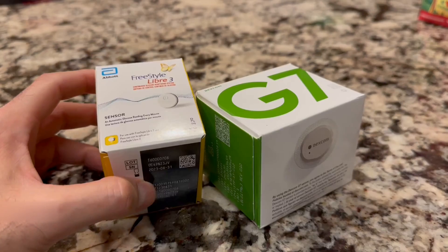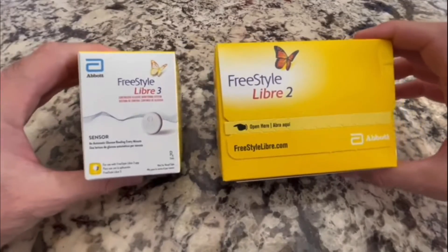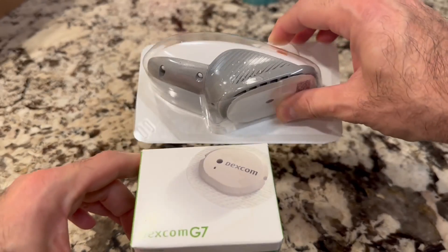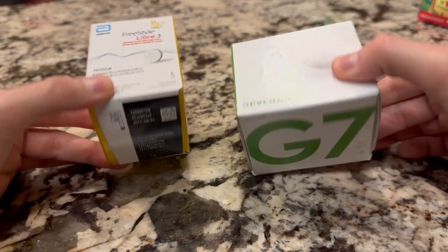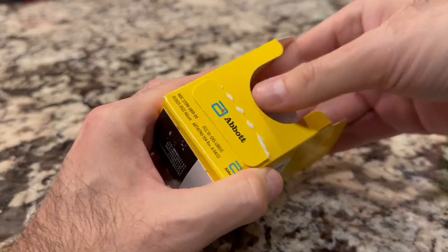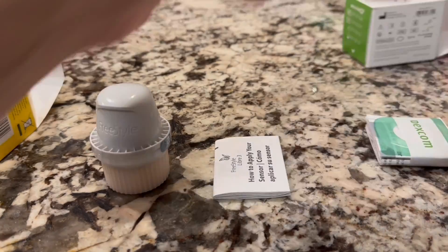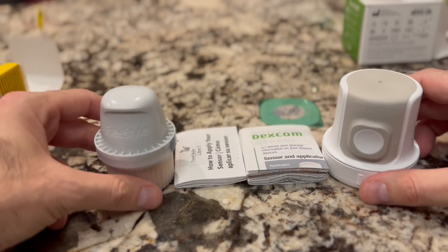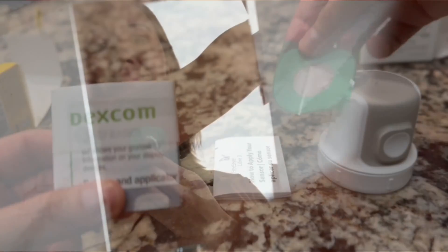Let's take a look at what these devices look like. The boxes for both the G7 and the Freestyle Libre 3 are much smaller than their predecessors, the Libre 2 and Dexcom G6. Compared to each other, they're both very small and very similar in size. Both boxes include the applicator as well as the usual instructions and safety info. The Dexcom G7 has an added bonus not included with the Libre 3 — a nice overlay patch to keep the sensor from falling off.